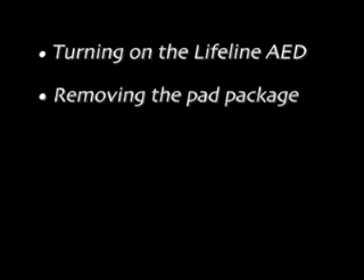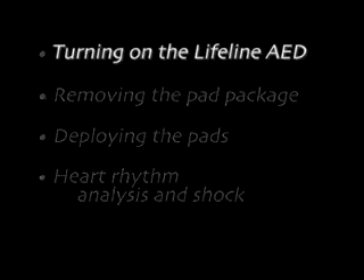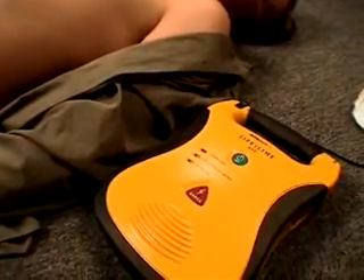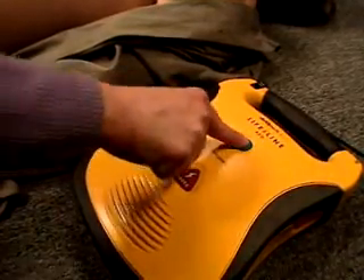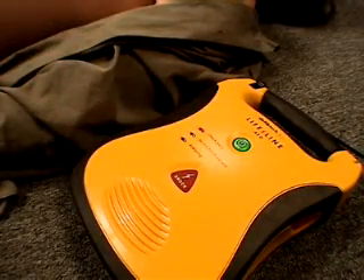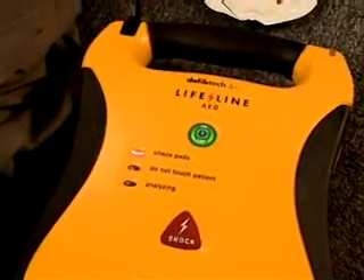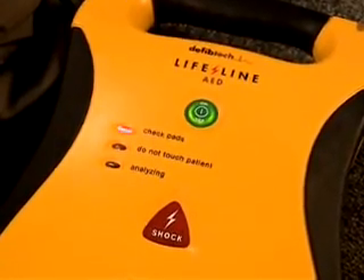Let's review the basic steps involved in actually using the Lifeline AED. Once you've determined that the victim needs treatment, start by turning the Lifeline AED on — simply press the on-off button. Once the AED has been turned on, it will guide you using voice and visual prompts.